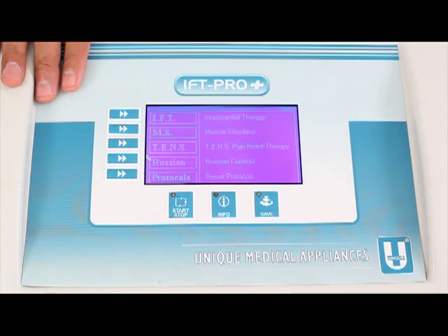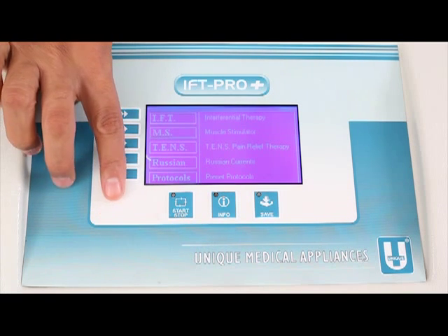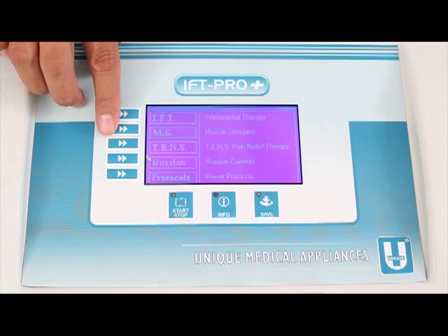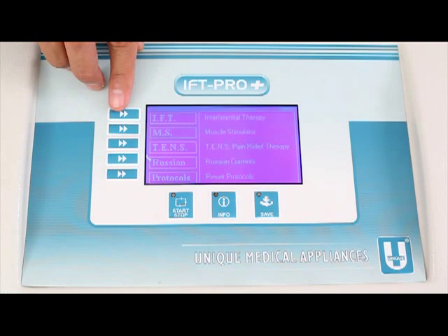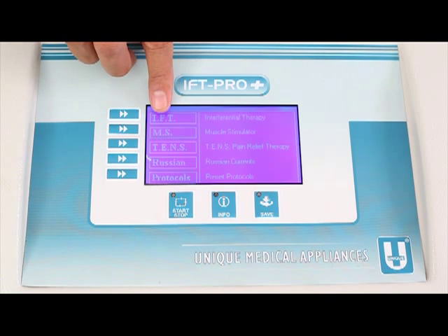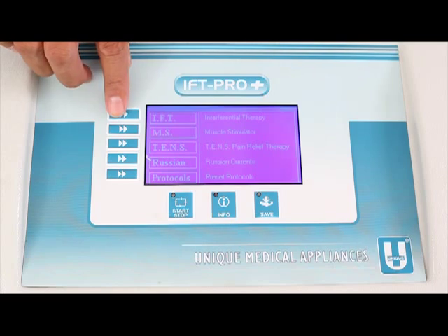The machine announces the main menu: F1 IFT, F2 Muscle Stimulator, F3 TENS, F4 Russian Currents, F5 Protocols. The machine announced that from F1 to F5 there is a selection between IFT, Stimulator, TENS, Russian, and Protocols. The same things are being displayed on the main display. So now if a user wants to go into the IFT menu, they just press F1.